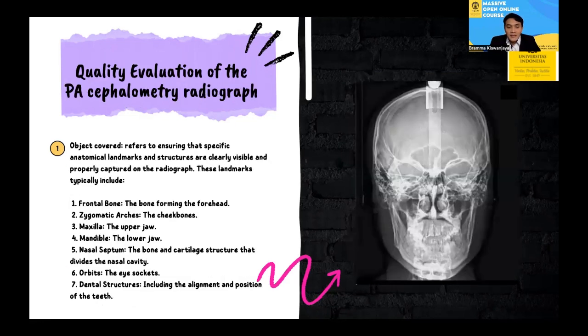Having covered lateral cephalometric radiographs in detail, let's transition to posterior-anterior cephalometric radiographs. This section will address the evaluation of craniofacial asymmetry and other craniofacial features.